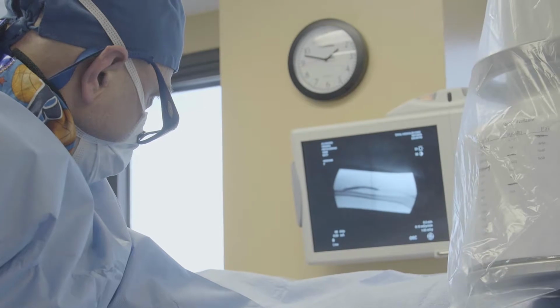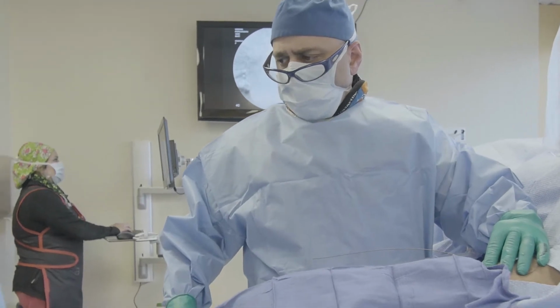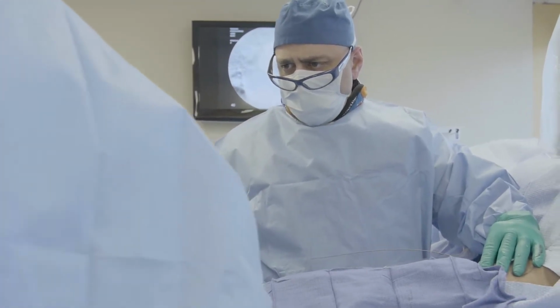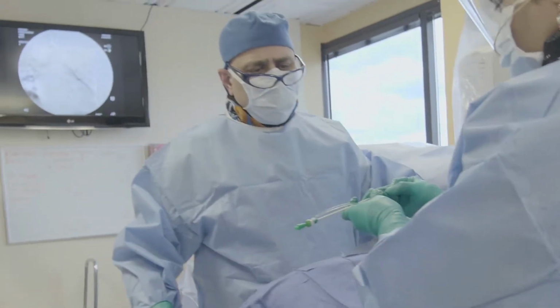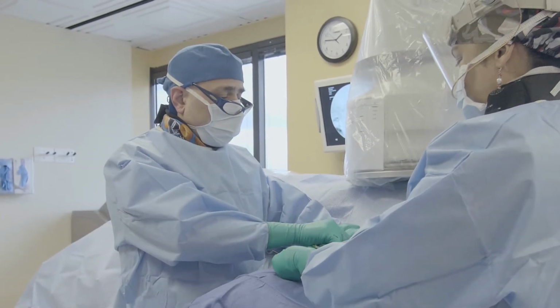As part of what we also do at Total Vascular Care, we do renal sonograms. Sonograms are done to basically evaluate the nature of the patient's kidney disease in some scenarios. One of the most common genetic disorders is a disease called polycystic kidney disease. That would easily be identifiable by a renal sonogram. We also perform ultrasound to diagnose single cysts, stones, any other type of abnormality that may clue us into what is going on with the patient's kidneys. So that is an important part of patient care in patients with chronic kidney disease.